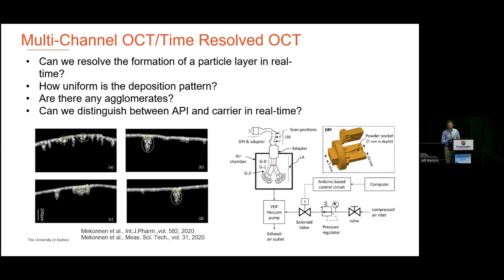And so you get an idea of what this looks like. These are images of the deposited particle layers at a few different locations in the upper airway. And you can also extract information like this from the lower airway. So what you end up seeing is that as the particles land on the airway, they tend to form stacks of agglomerates. Even if they're fully aerosolized and then they land on the airway, we don't normally see a monolayer there. We see a stack of particles.